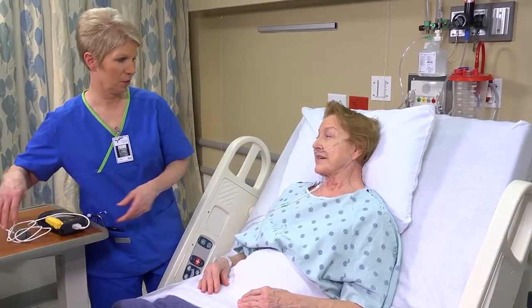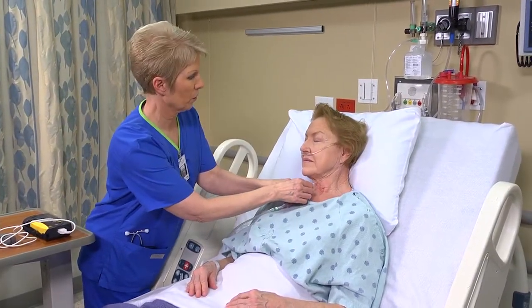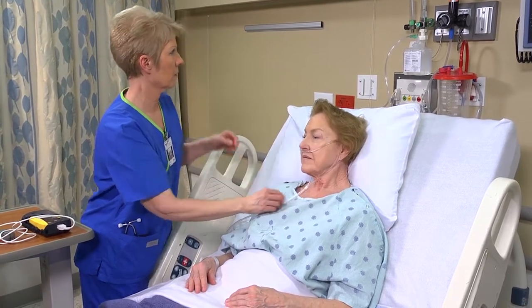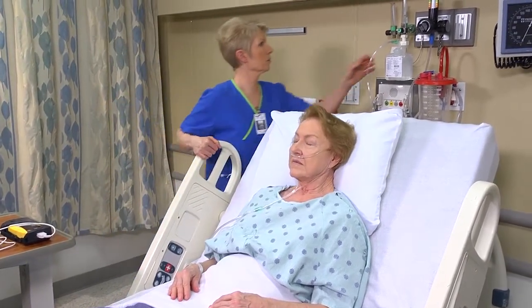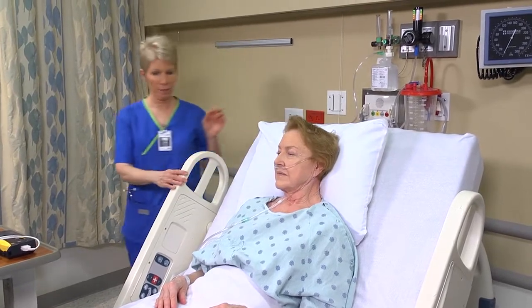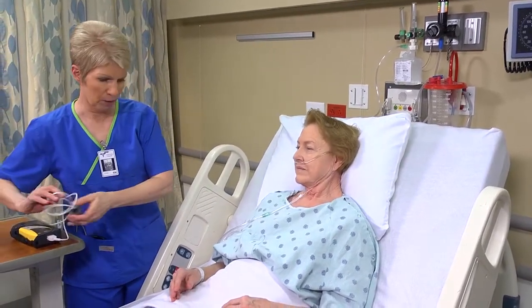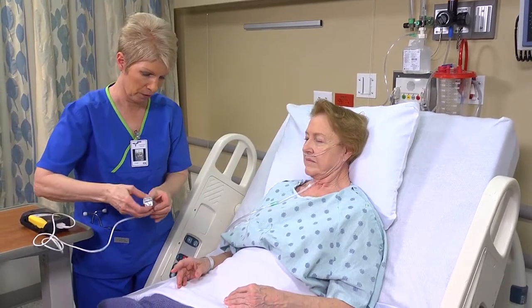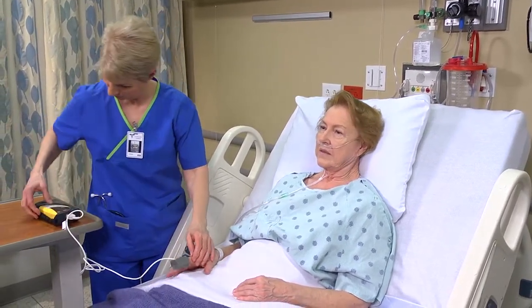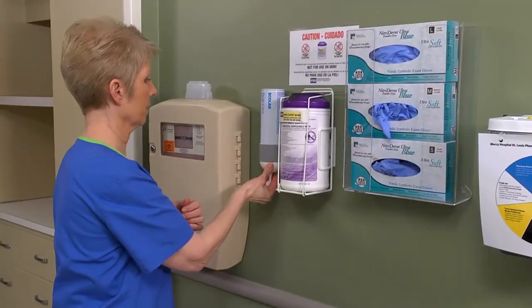Check the cannula or mask every 8 hours and keep the humidification container filled at all times. As part of your follow-up care, monitor the patient's pulse oximetry and arterial blood gas levels if needed. If either is out of range, notify the healthcare provider, as a flow rate adjustment may be in order. When you're finished, perform hand hygiene.